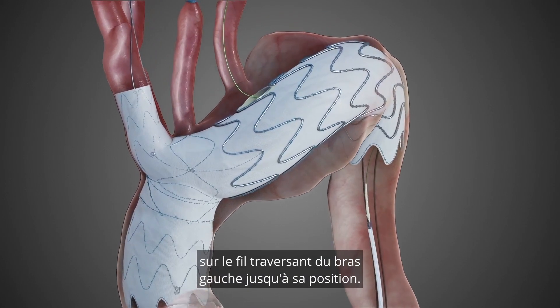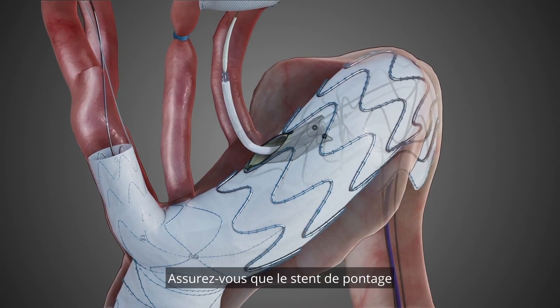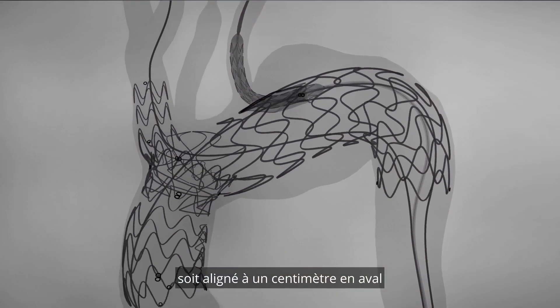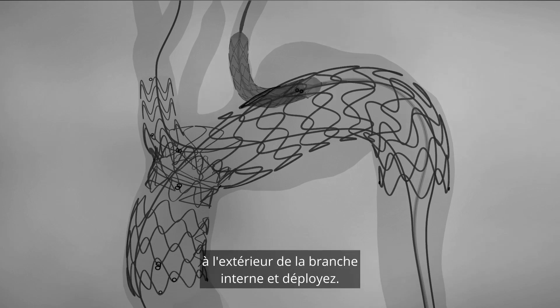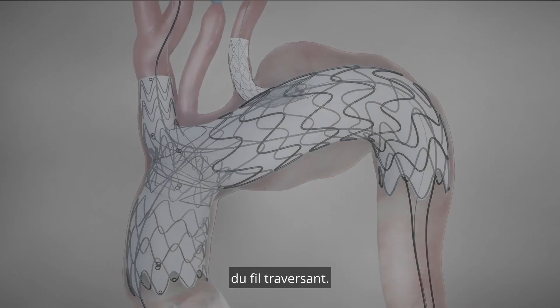Advance the bridging stent over the left arm through and through wire to its position. Ensure the bridging stent is aligned one centimeter distally outside the inner branch and deploy. Remove the bridging stent balloon from the through and through wire.